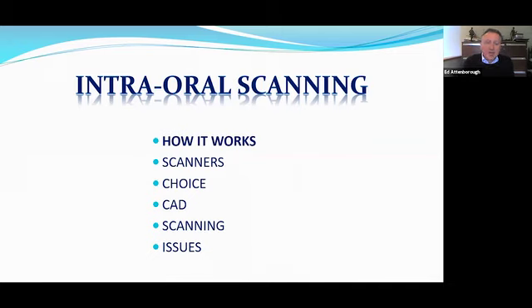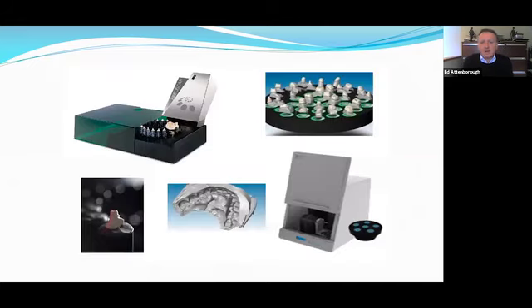So let's have a look at how the technology works. Basically, all intraoral scanners are based on the same technology as desktop scanners, and this was developed probably 30 plus years ago. If you have a look at the scanners here on the screen, you can see a selection of desktop scanners, and the one top left is a scanner that we started with 20 years ago, and believe it or not, it's still the same technology today. Obviously, the scanners are quicker. They're not necessarily more accurate, interestingly enough, but they are quicker. They've become a lot more advanced. But the basic technology remains the same.